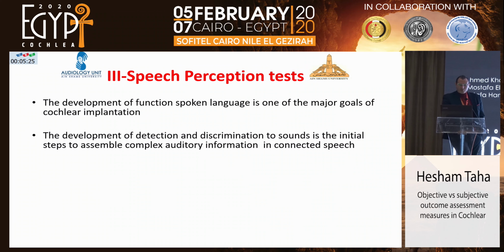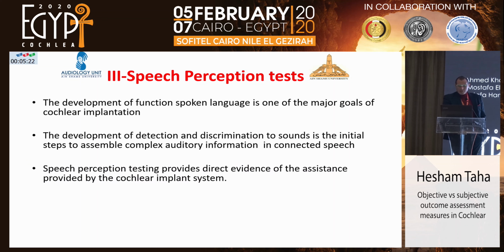The development of detection and discrimination of sounds is very important to assemble complex auditory information in connected speech. Speech perception provides direct evidence of the assistance provided by the cochlear implant system.